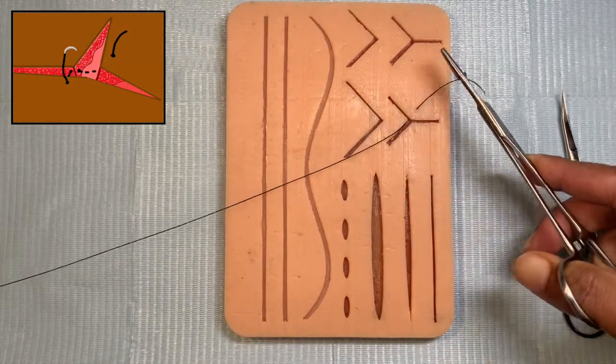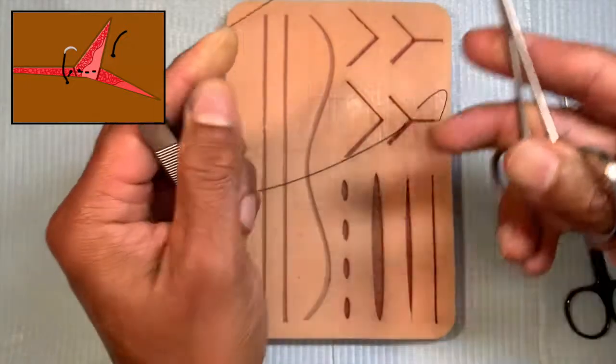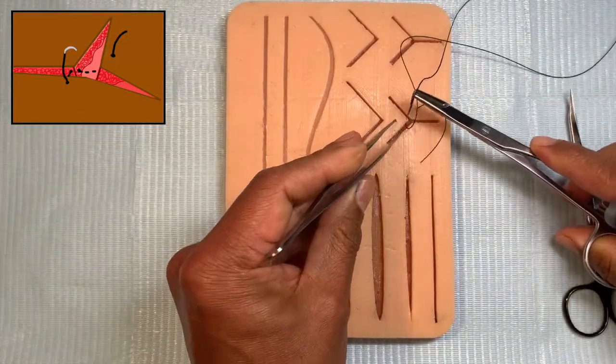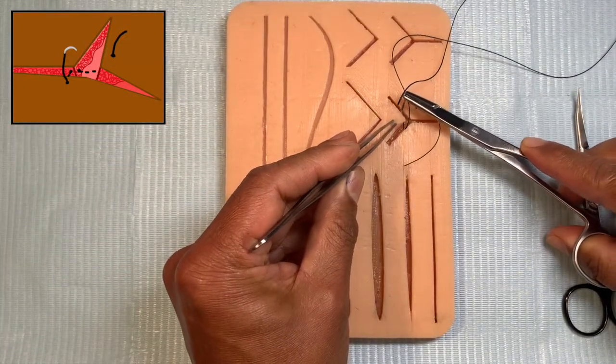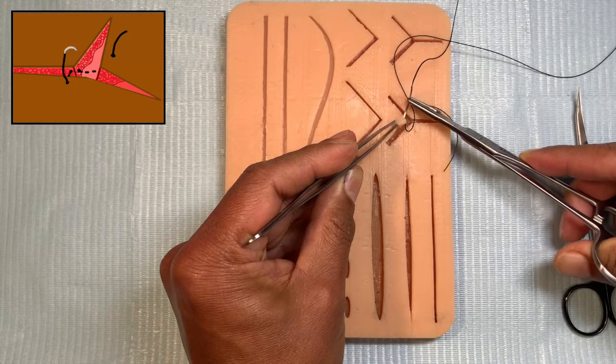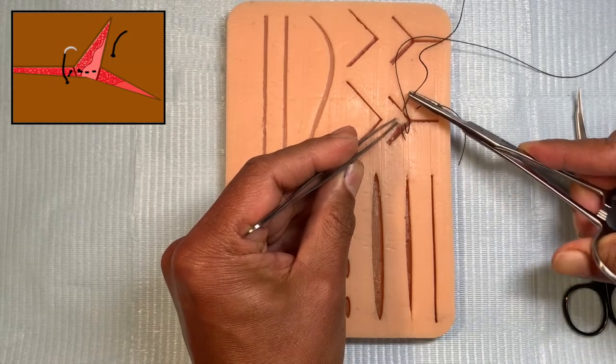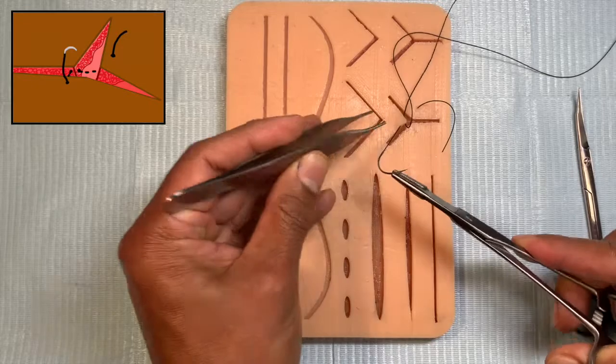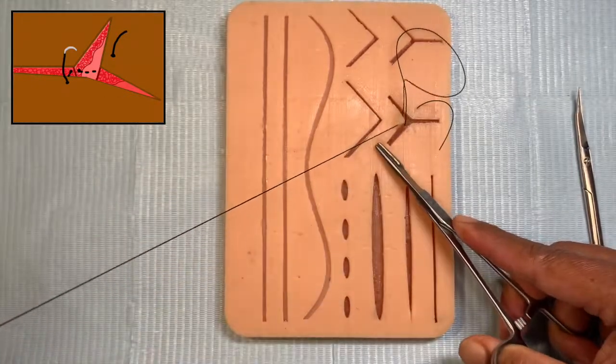Shorten the suture, don't keep this end too long. And then here what you want to do is bring it through the papillary dermis. So you take a good bite from the papillary dermis and come through that.